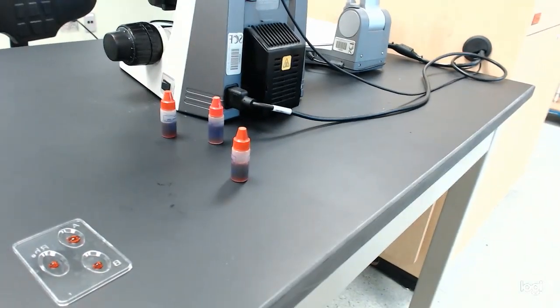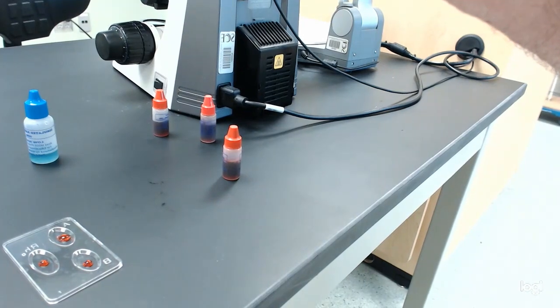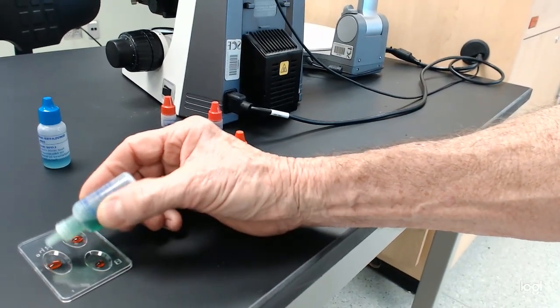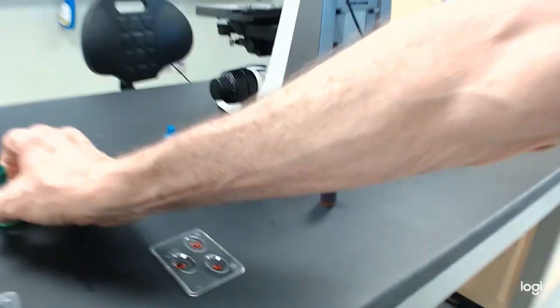And I'm going to put a drop of the B one in B. This is the RH one. The green one happens to be the RH tester stuff. And here I have, whoops, my camera's falling over.